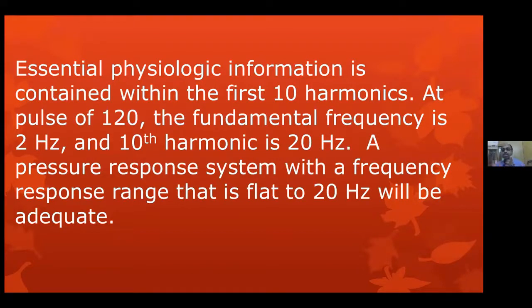The reason why I brought this concept is, if you are having a patient who is having more than 64 millimeters of mercury peak gradient and 40 millimeters of mercury mean gradient on echocardiography, and let us assume you are referring it for surgery, the surgeon goes and replaces the valve, nobody measures any actual hemodynamics, and so we don't know anything.